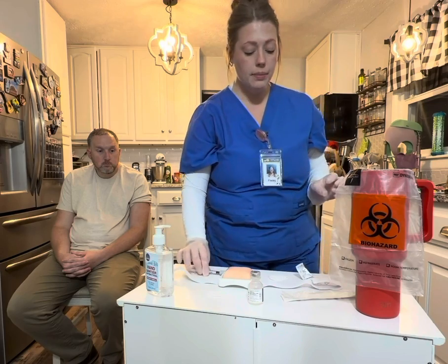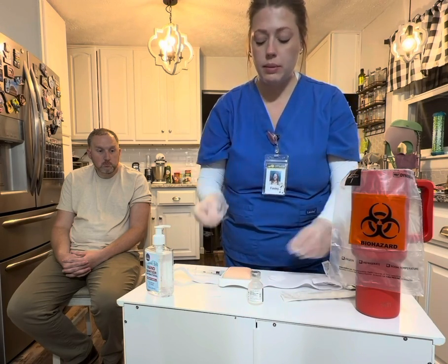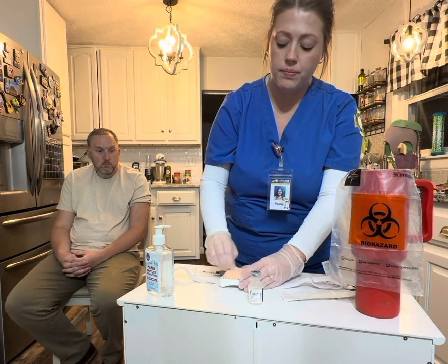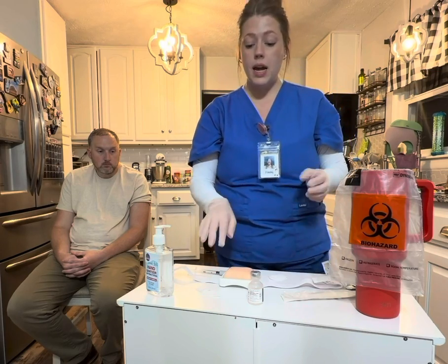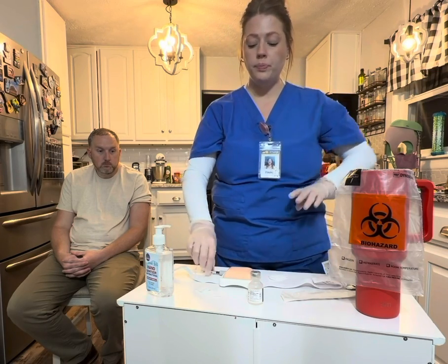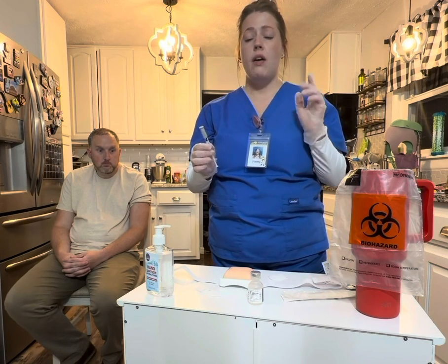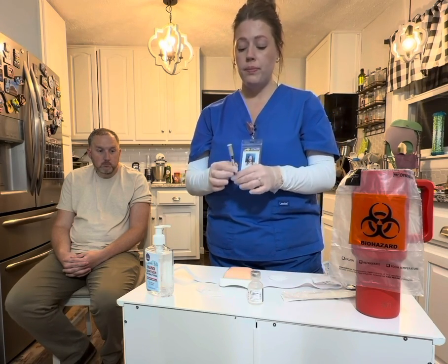So then that's ready. Then what I'm going to go ahead and do is clean my tissue in a circular, firm motion. And then I would allow that to air dry. Make sure we don't blow. And then with subcutaneous, you can go in at a 45-degree to 90-degree angle. So for this demonstration, we're going to go in at a 45-degree angle.